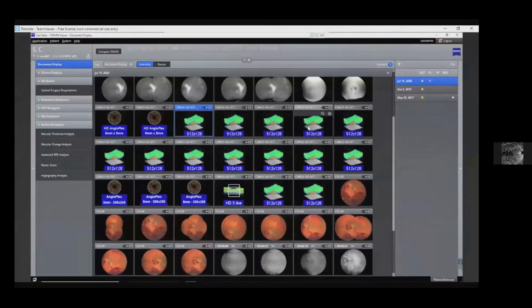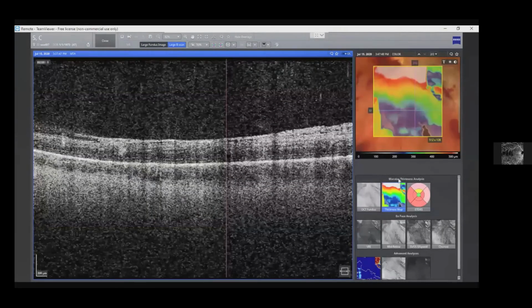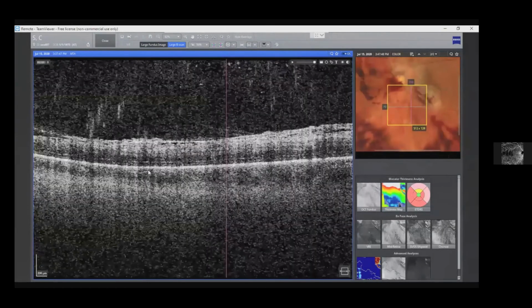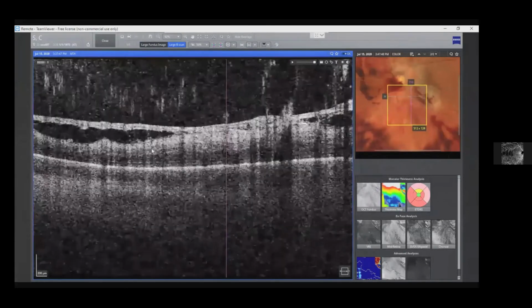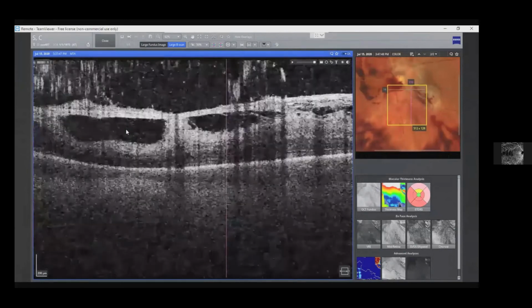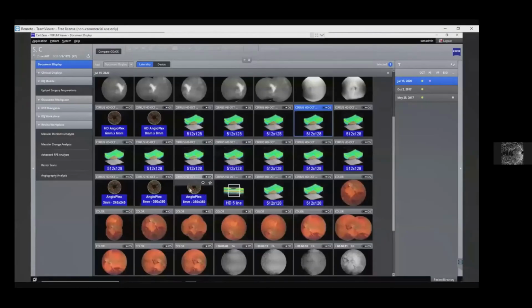I did these little cubes throughout the macula, and you'll see that here. Let me scroll here again. You'll start to see some more planes developing here where you can undermine this and lift off this fibrovascular tissue and really help this patient's vision. So a nice way to use this multimodal overlay, both for initial diagnosis as well as surgical management. So I think that's a nice technique. So that's patient SC. Let's move on to a patient with a different disease.